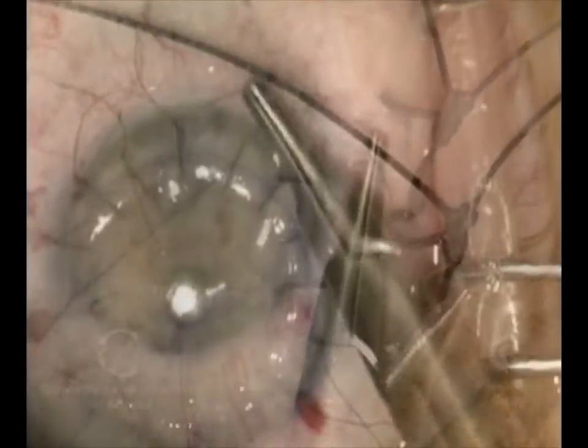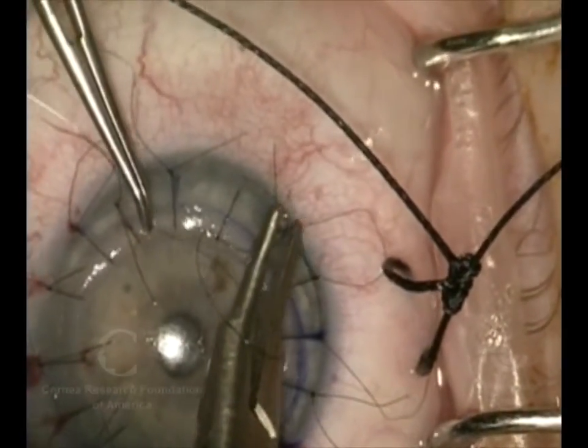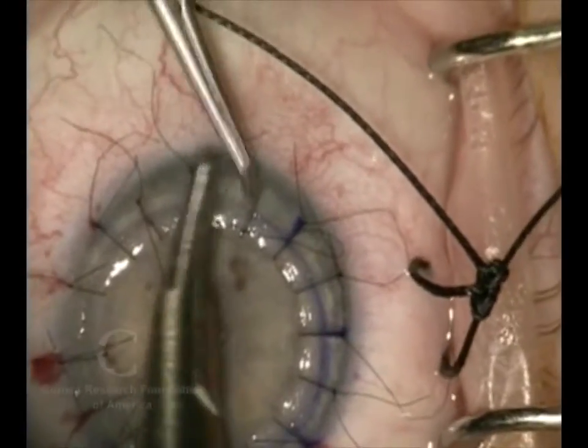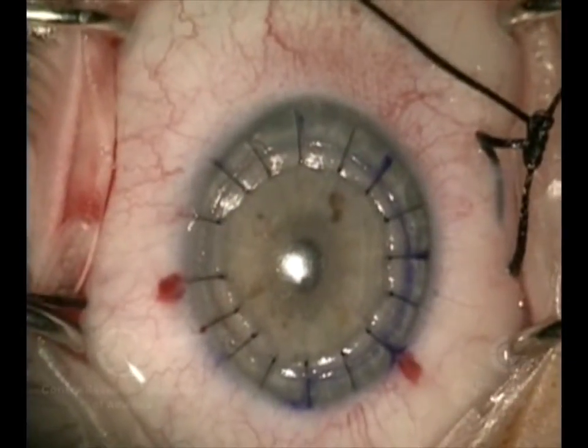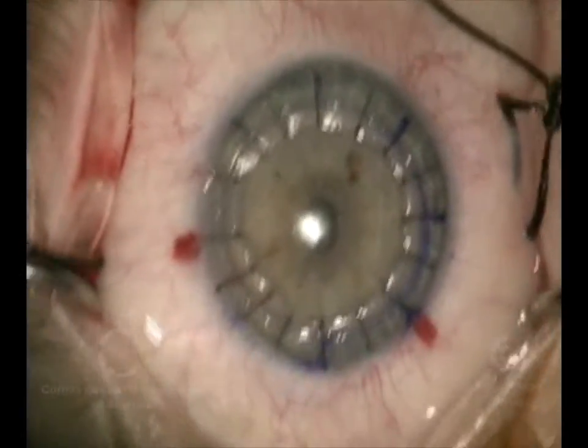It's very important that your surgeon is experienced in doing this, because you want to make sure that the suturing is done well and that there's good apposition between the thin inner layer and the new outer layer.